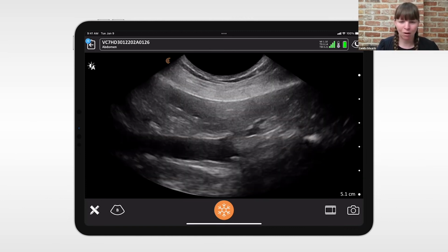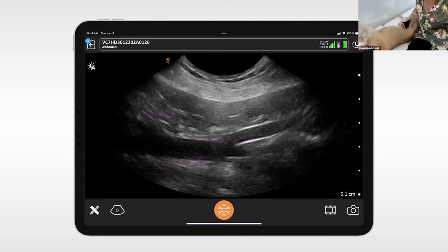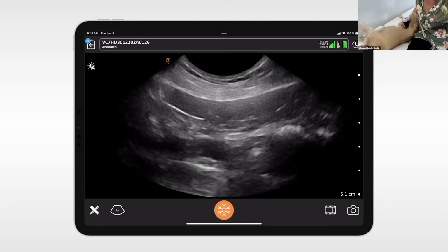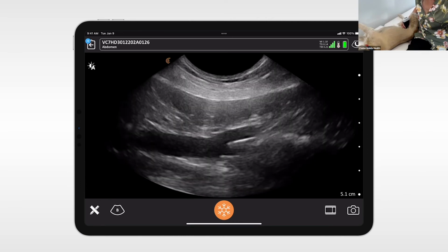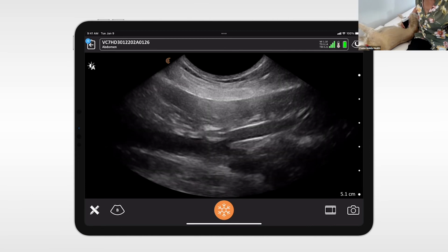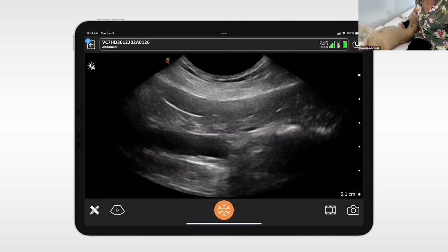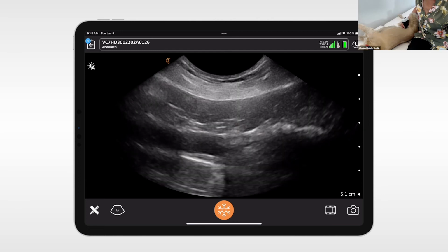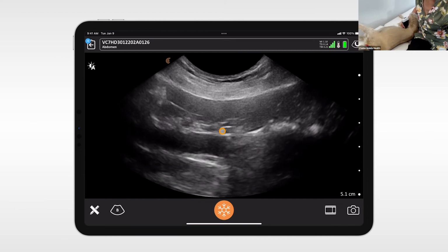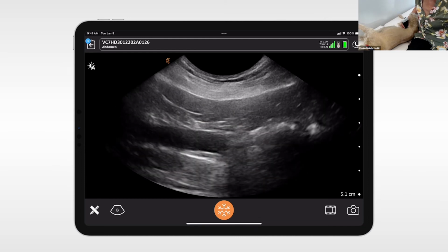Nothing's jumping out at me just yet. Is it going to be like kind of sitting on top of it like we saw before, or not necessarily? Yeah. So it's very similar to the other side, but sometimes we need to fan a little bit in that area, in that region. That may be it there, or is that too high? No, I think that could well be it.